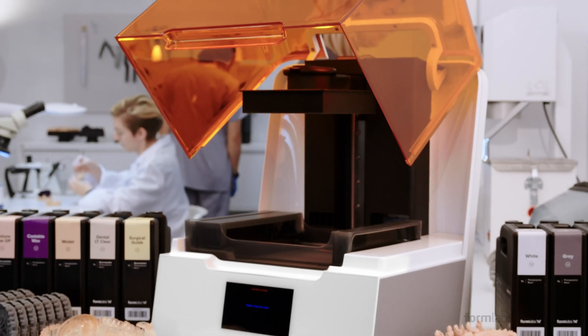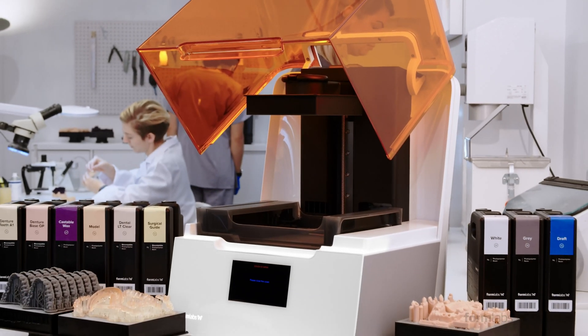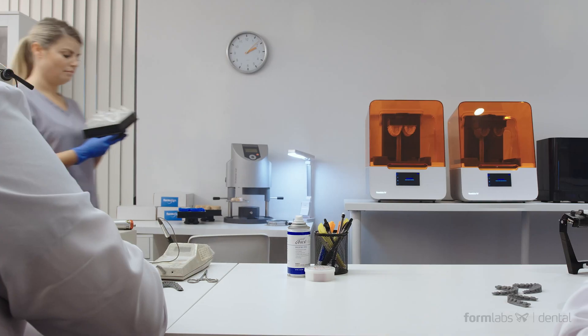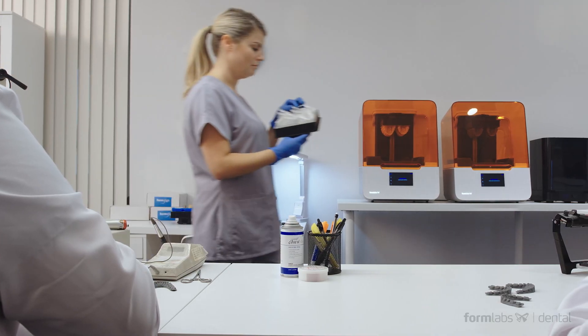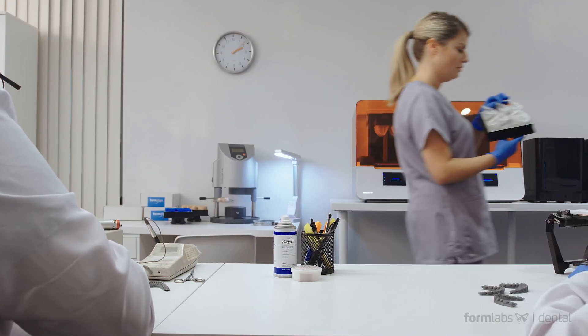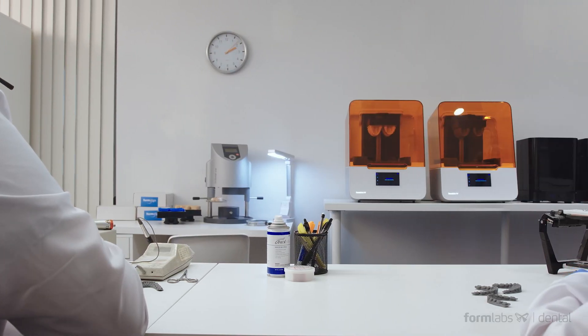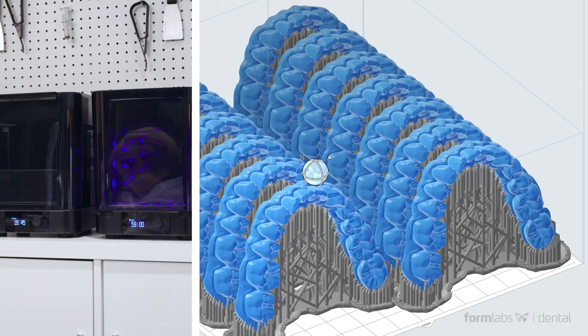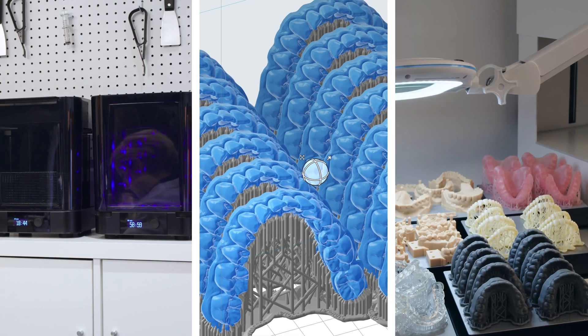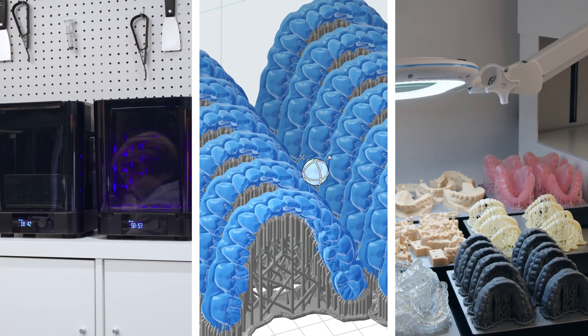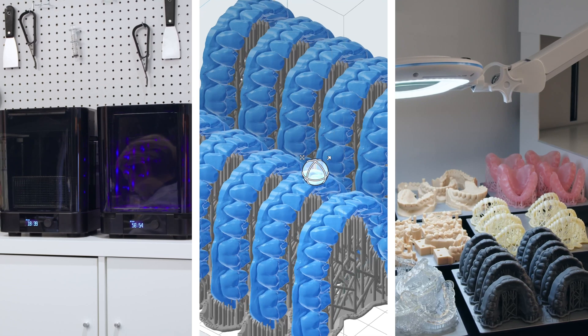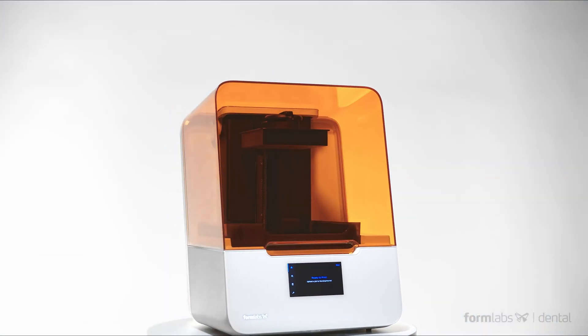And with our years of experience as the leaders in desktop digital fabrication for orthodontics practices all over the world, you can trust that Formlabs hardware, software, and materials are tried and tested from start to finish to deliver the best clinical outcomes.